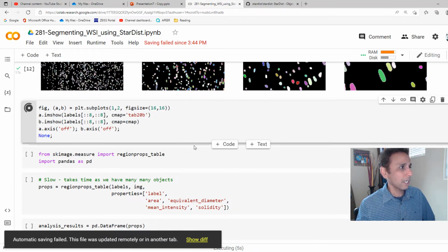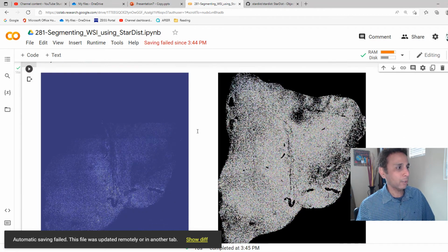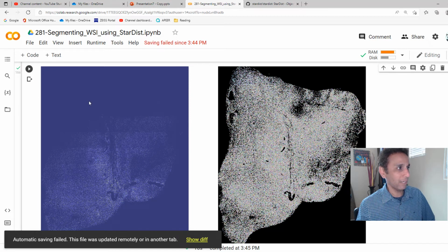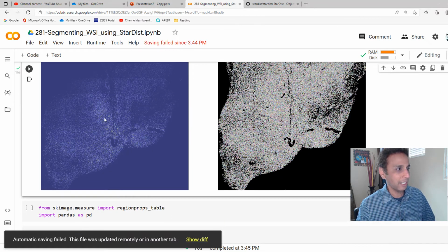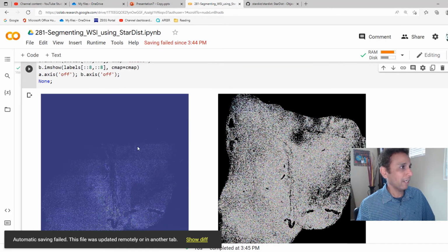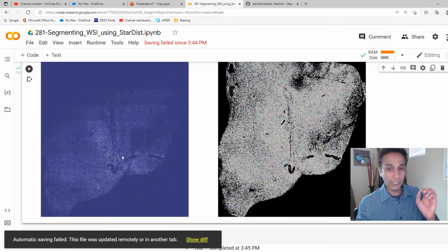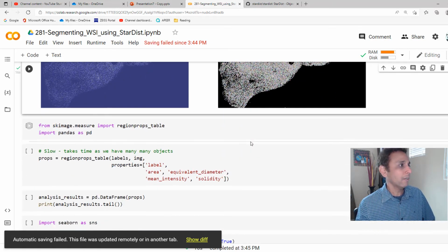So there's a lot of plotting going on here. Okay, so why am I doing this? This is basically the object number, right? It starts with object number something, and it goes all the way down to whatever that object number is. I believe I have 200,000 some objects, and this is actually showing you the object ID or number all the way from 0 to 200 some thousand. And this is basically all objects randomly colored. Just a different view for us.